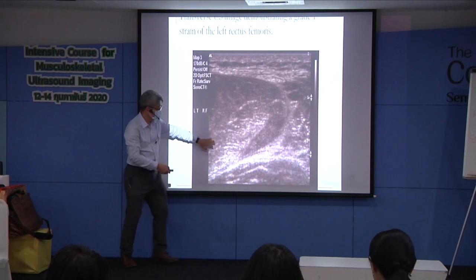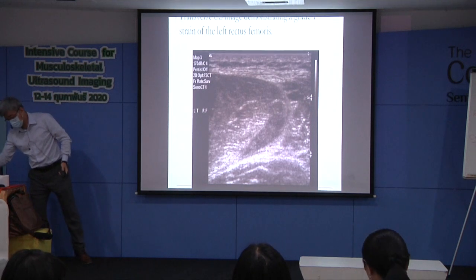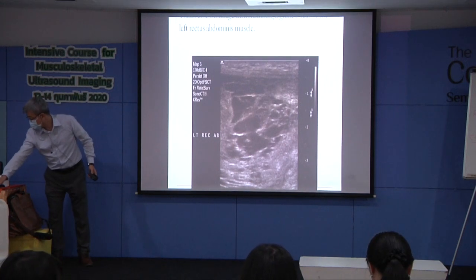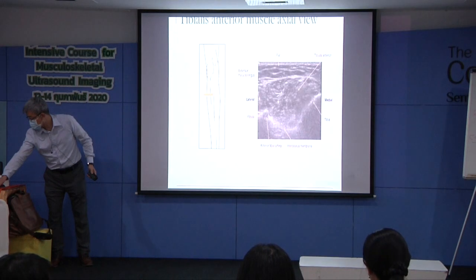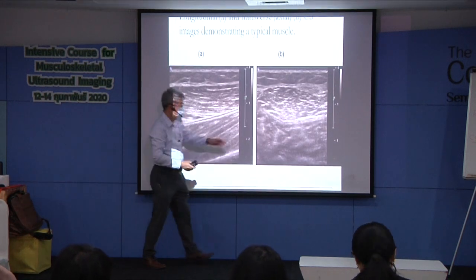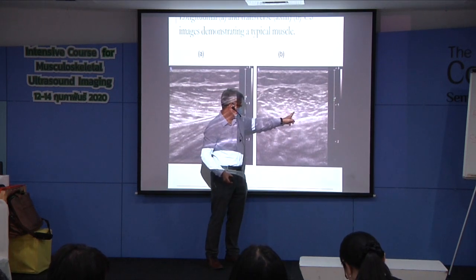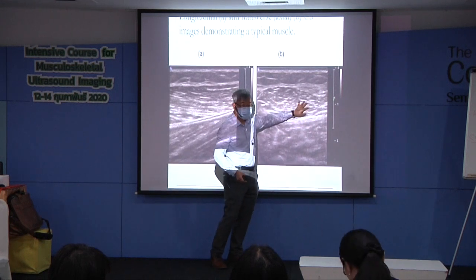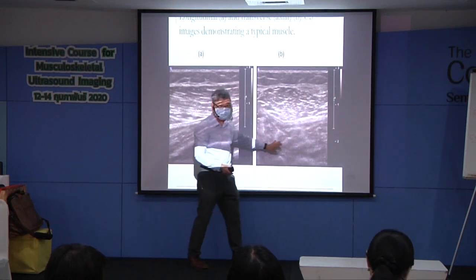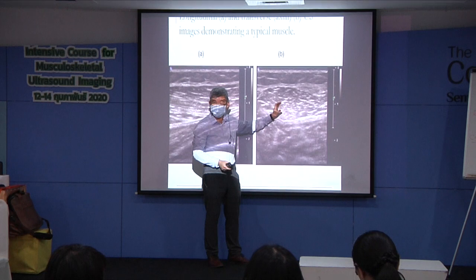This is a transverse view of muscle. This is the standard view of muscle transverse. You can see the deep aponeurosis over the fascicle. Within the muscle is very bright. This is standard. No hypoechoic in this area is normal.